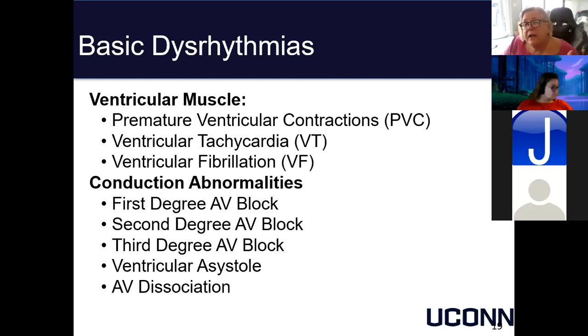Ventricular tachycardia is when you've got a whole string of PVCs together. It's on a run. It's not considered ventricular tachycardia until you have 3 PVCs in a row. That's not to say bigeminy, and then trigeminy would be every third, 2 normals and a PVC, 2 normals and a PVC. So that's what we talk about with bigeminy and trigeminy.